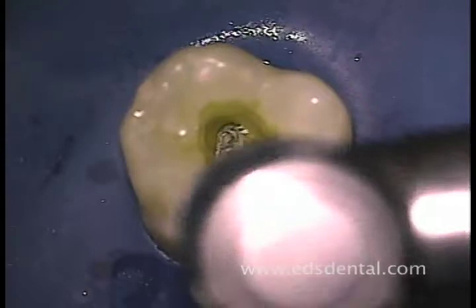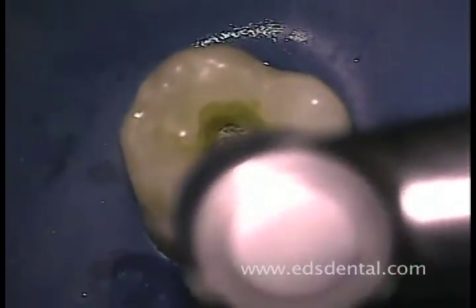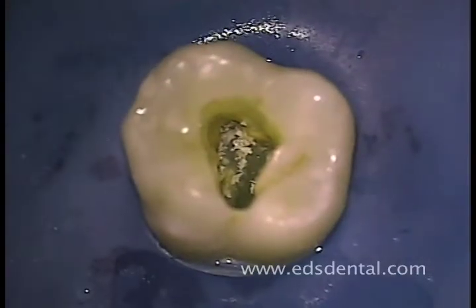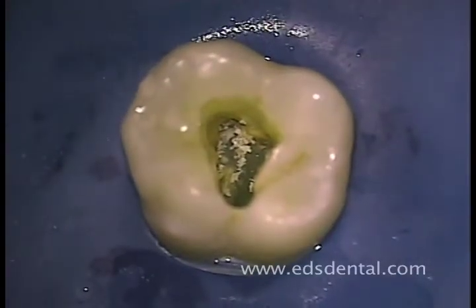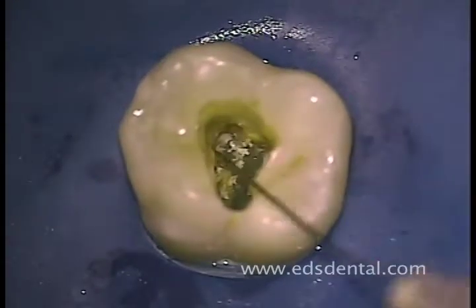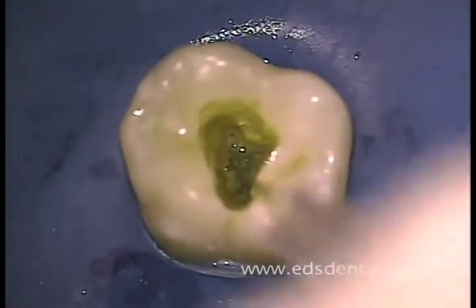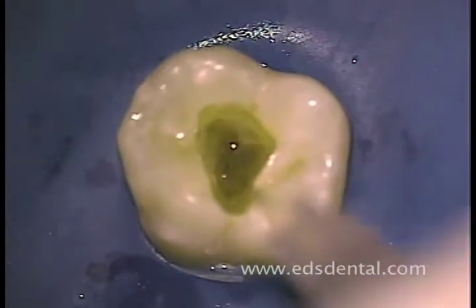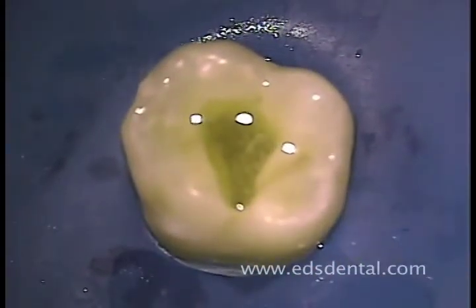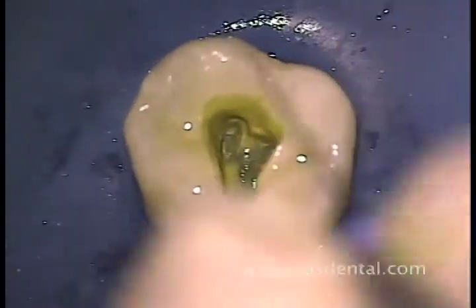I relieve some of the overlying dentin with the No. 1 Munce bur, and after irrigation, I clearly see a black groove that travels buccolingually along a line that is somewhat more mesial than the original chamber opening. I remove the overlying dentin both mesially and distally along the length of this dark groove and follow with more irrigation. The dark groove is now more evident, and I start to explore this highly oval space with 08 reamers.